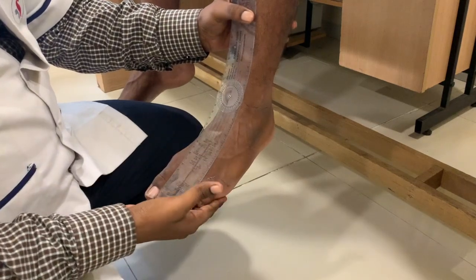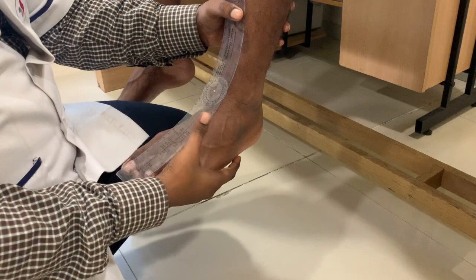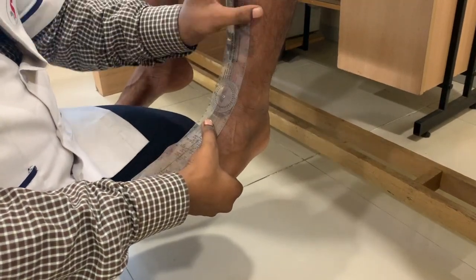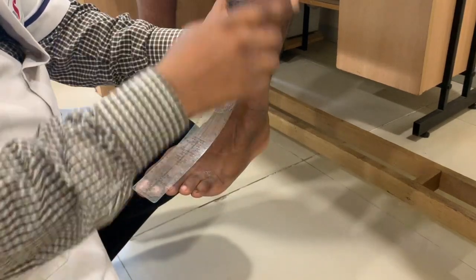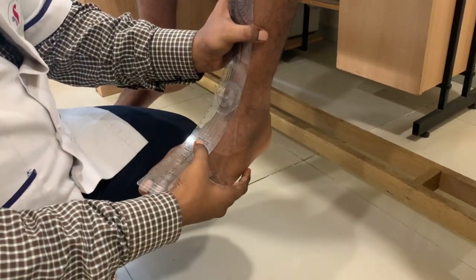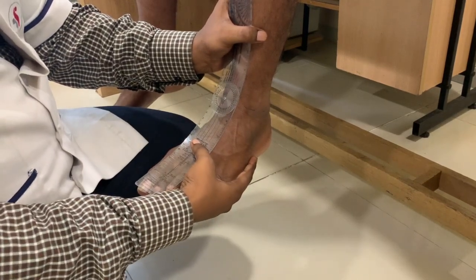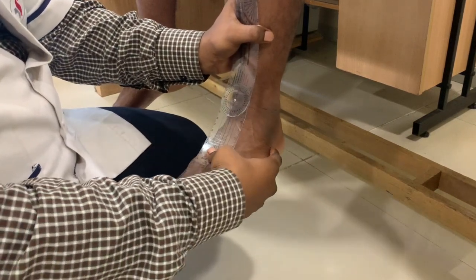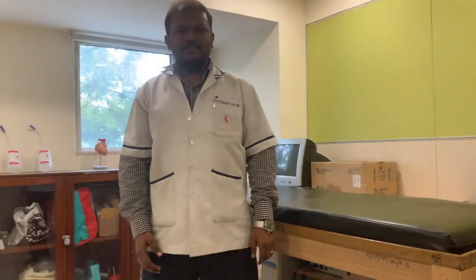The ankle should be in neutral position. The stabilizing arm should be pointed towards the patella, and the movable arm should be parallel to the second metatarsal. Here you can do inversion and eversion range of motion for the subtalar joint.